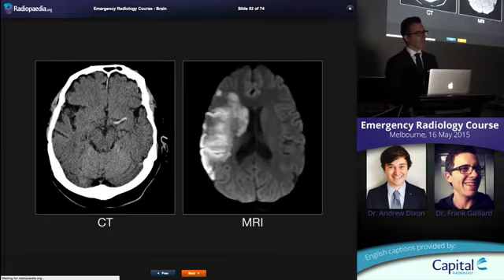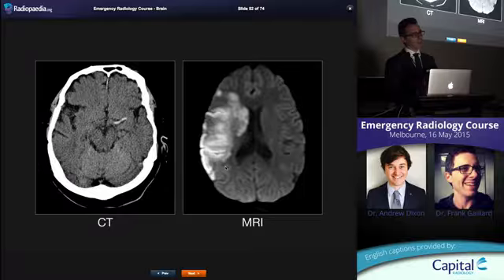If we could, we'd have MRs available in ED everywhere, because MR is probably the best way of imaging stroke. DWI changes will occur within seconds or at least minutes of occlusion. It's a great way of predicting infarct core versus penumbra. It's got lots of other benefits. The problem is getting a patient quickly into an MR is hard. One, because there's lots of safety issues, and two, there's just not that many scanners around and the protocols are much longer. So the bulk of what we image is CT.